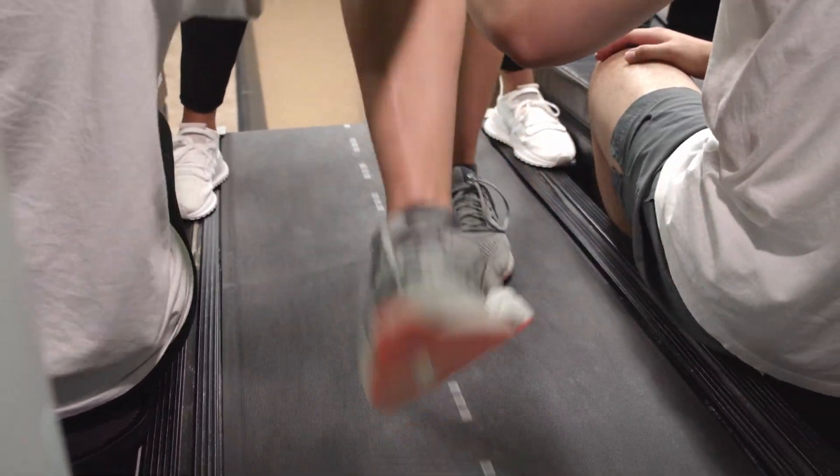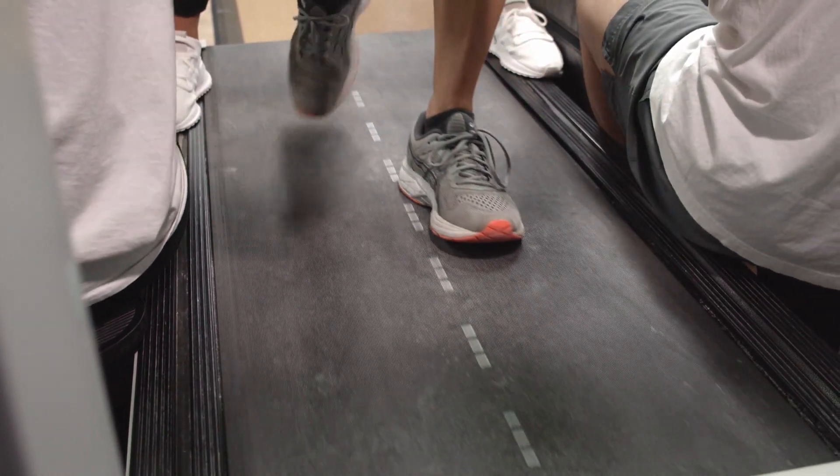She will bring in an individual from out in the community who does have a neurological injury, and students will be able to practice those techniques on that individual. This actually occurs right before they go on their clinical internship.